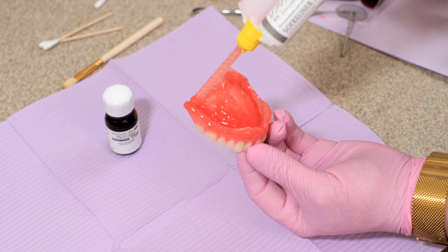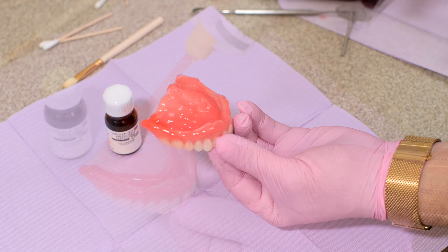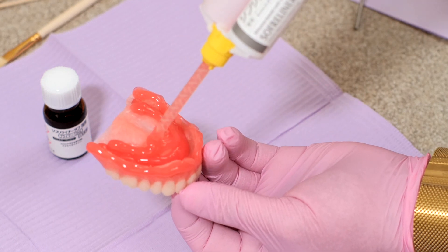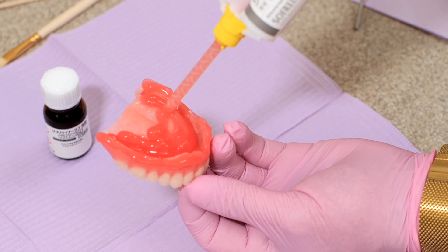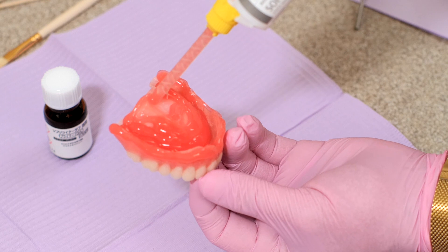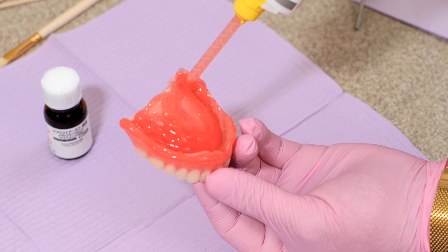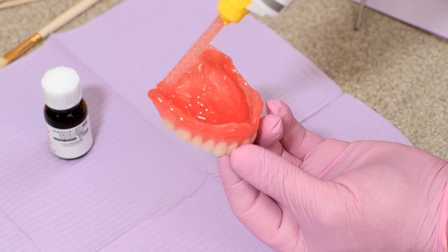One of the tips and tricks I like to use to avoid air bubbles in the Soft Reline process is to make sure that the tip of the applicator stays buried within the material itself. As you can see here, we keep the tip buried in the material and that avoids the introduction of air to or under the Soft Reliner Tuff.